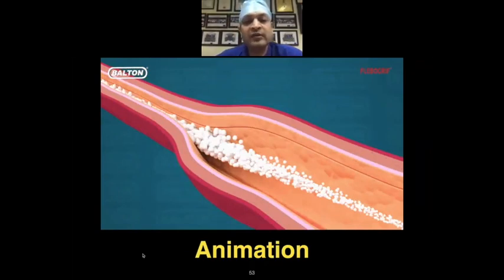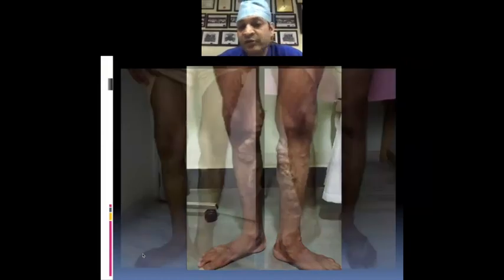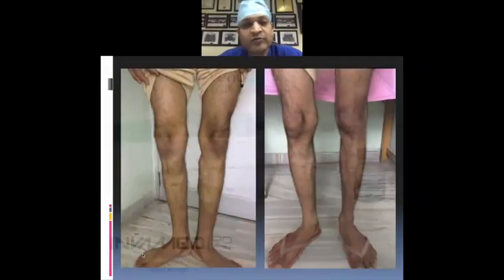The closure rates with all these technologies are not better than laser and radiofrequency. So I feel there are some particular patients where you can use this technology, but not as a standard of care. This is just one of the examples with the foam and MOCA that we've used.